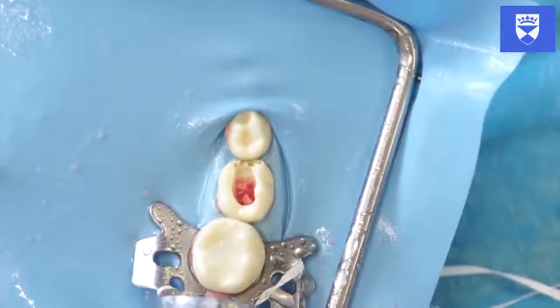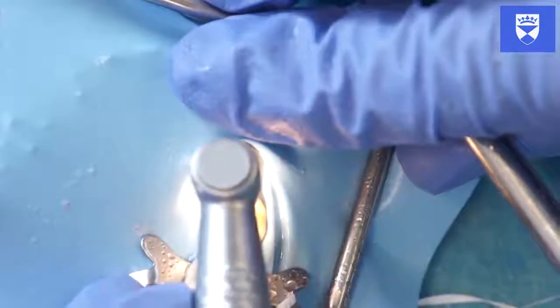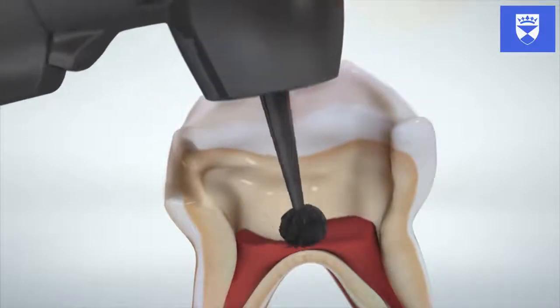Remove the coronal pulp with a large rosehead burr in a slow handpiece. Alternatively, a large excavator can be used. The pulp stumps should be visible. Care must be taken when removing the pulp tissue overlying the cavity floor, as this is very thin and overzealous preparation can lead to iatrogenic perforation.